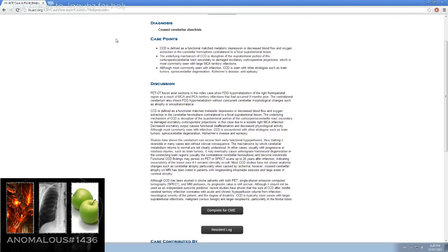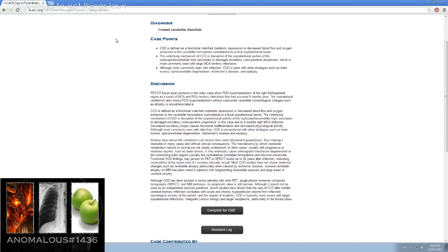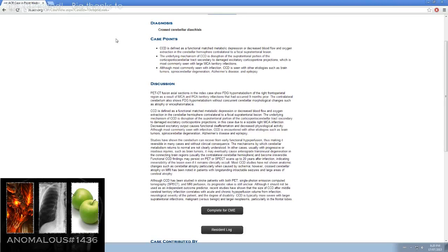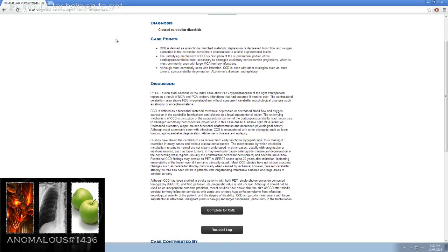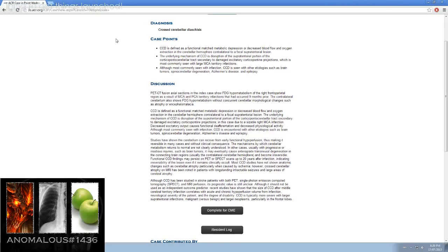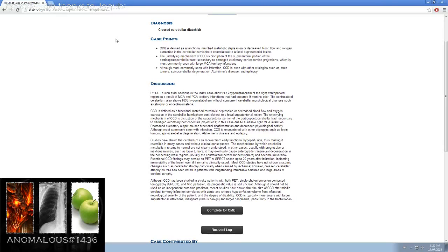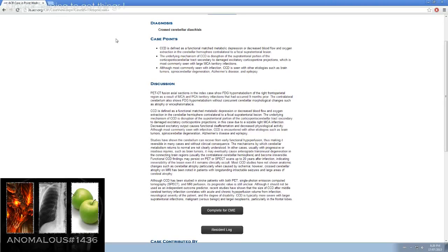Although CCD has been studied in stroke patients with both PET, single-photon emission computed tomography or SPECT, and MRI perfusion, its prognostic value is still unclear. Although it should not be used as an independent outcome predictor, recent studies have shown that the size of CCD after middle cerebral artery territory infarction correlates with acute and chronic hypoperfusion volume from infarction, neurological severity of the patient, and the degree of disability.